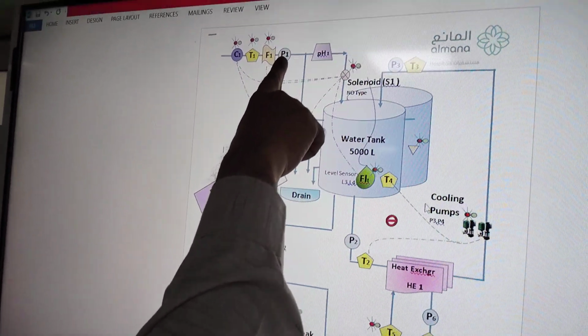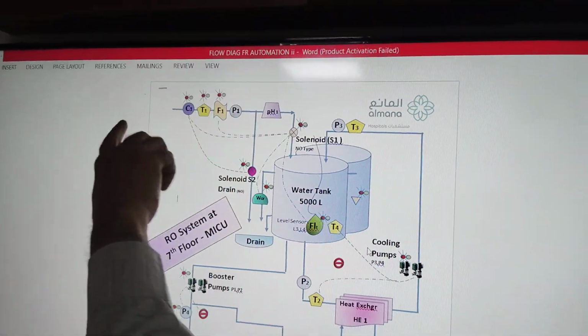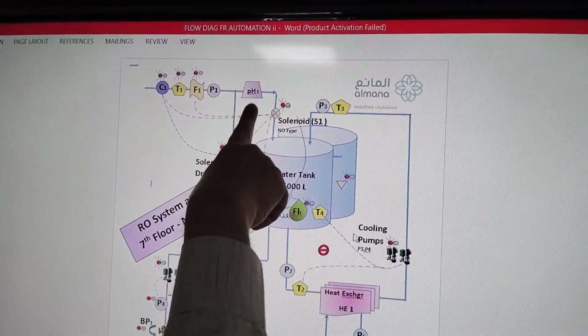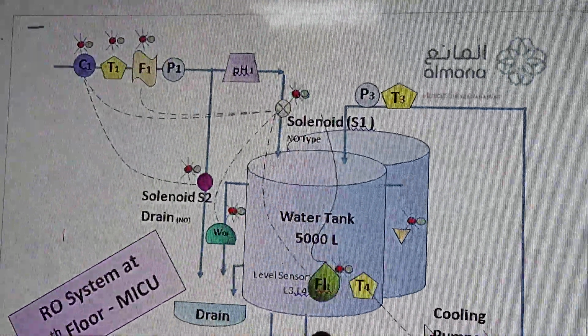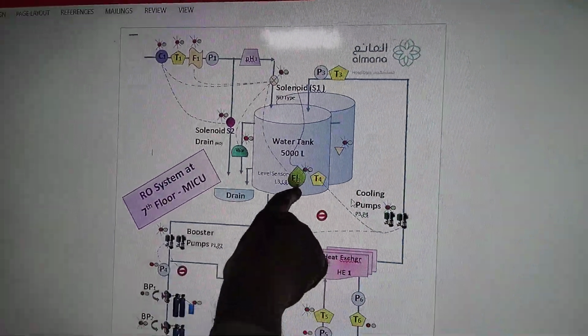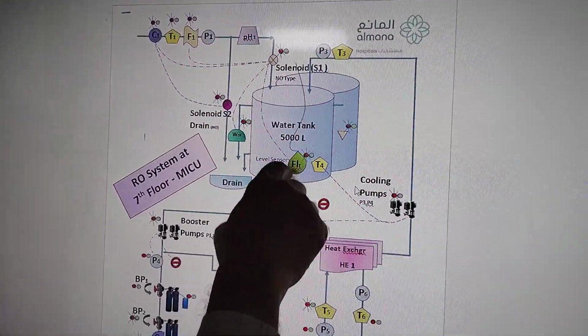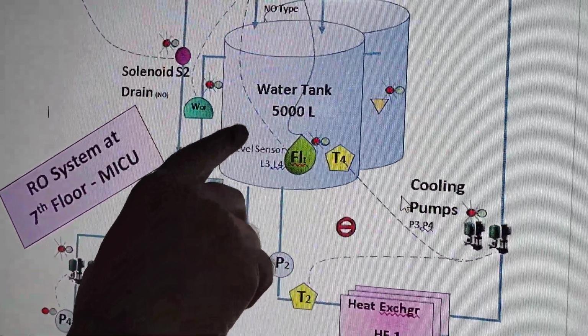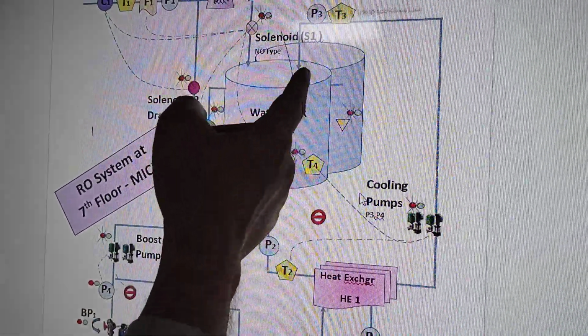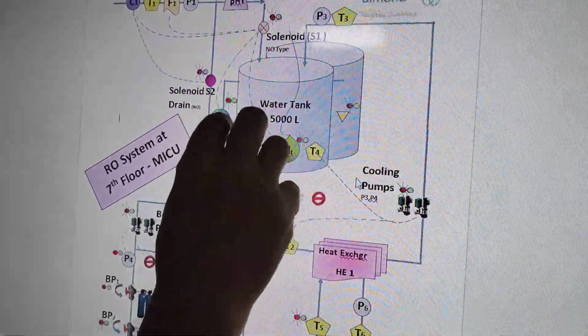And then it passes through the pressure sensor. It will monitor the pressure over there and keep on monitoring. The pH value is also monitored over here. And then there is a float sensor, a float valve. The float sensor will check the level of the water. It will check whether it is at 25%, 50%, and then 100%.